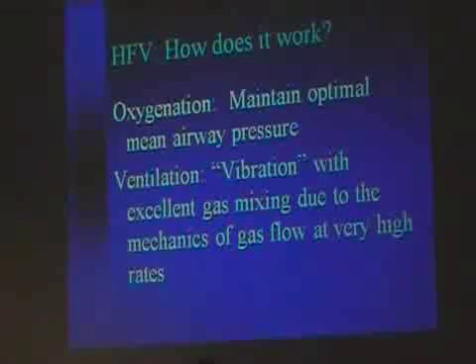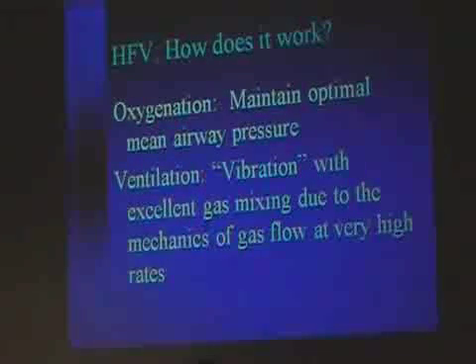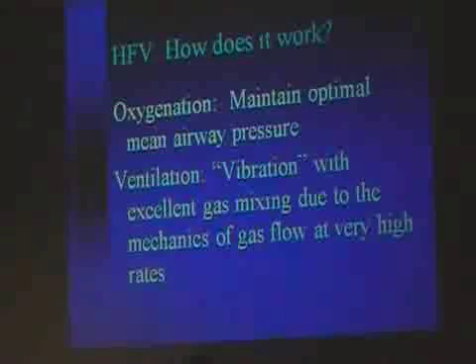So, oxygenation, how does it work? Maintain optimal mean airway pressure. Is that any way different from what we said during conventional ventilation? Not at all. These major precepts still apply. For oxygenation, we must maintain an optimal mean airway pressure, no matter what kind of ventilation we're using.